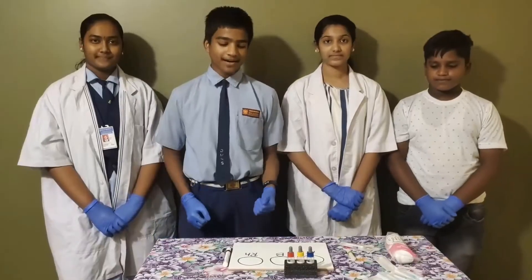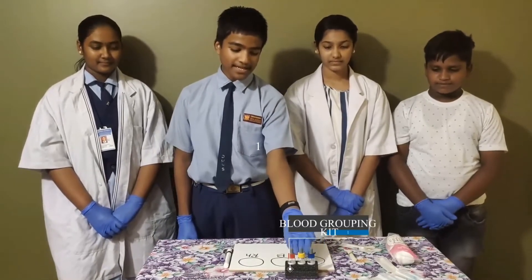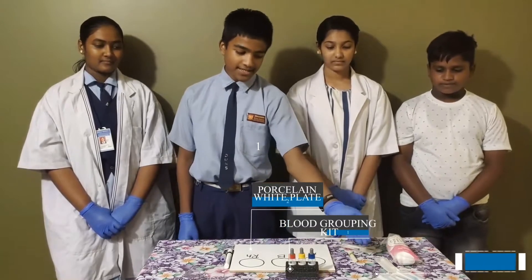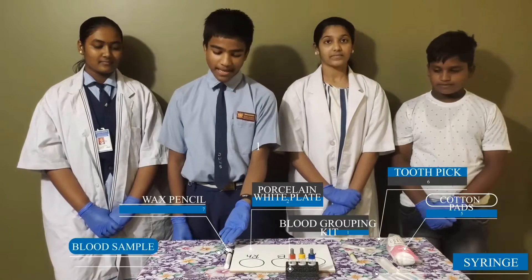The required materials are this kit which contains anti-A serum, anti-B serum, and anti-RH serum, a porcelain white plate, syringe, cotton pad, toothpick, wax pencil, and the blood sample.